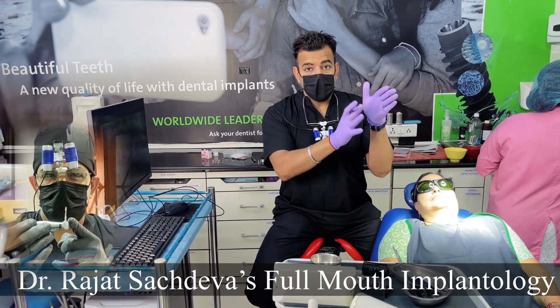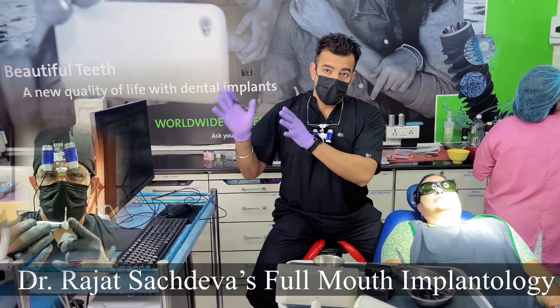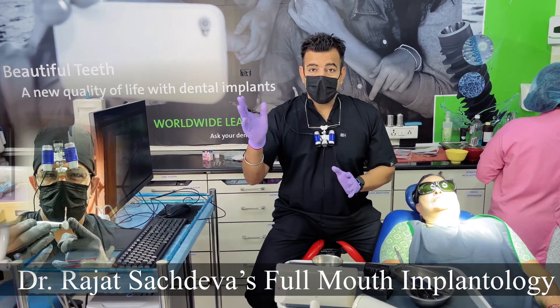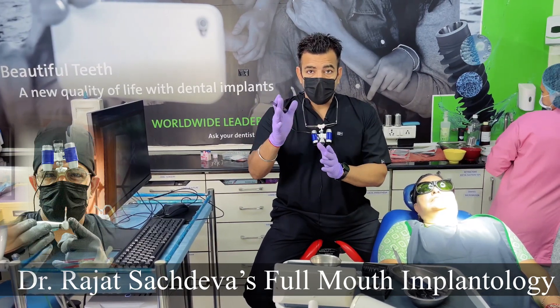Hi guys, now we are doing a case of prosthetic rehabilitation of the posterior jaw. I placed two implants in the maxillary — one was placed in the pterygoid and one was placed in the premolars. It was an immediate implant socket.